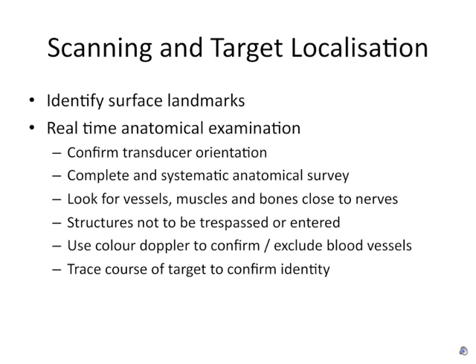When scanning prior to a procedure, it is important to accurately locate the structures of interest. Start by identifying surface landmarks for the target structure to guide probe placement. Ensure you are clear on probe orientation with respect to the image generated — the easiest way is to tap one side of the probe and correlate with the image. Then place the probe and perform a real-time anatomical survey, looking first for landmark structures such as blood vessels or bones.